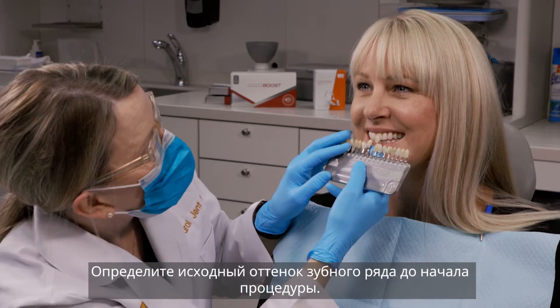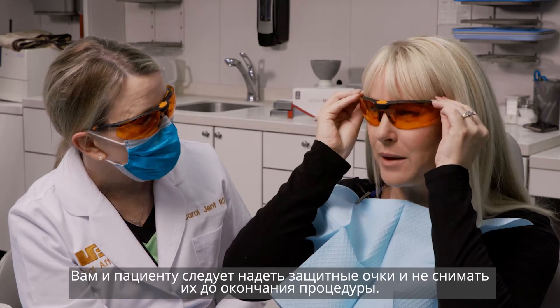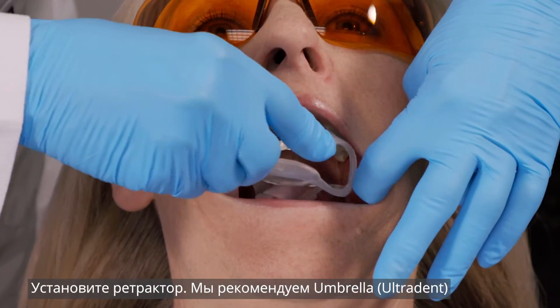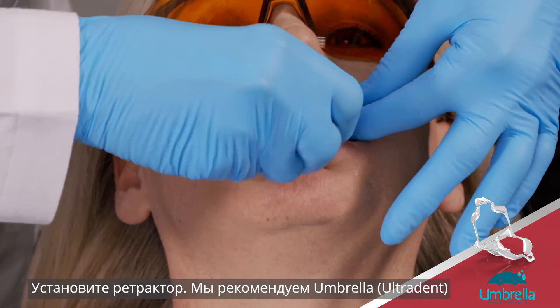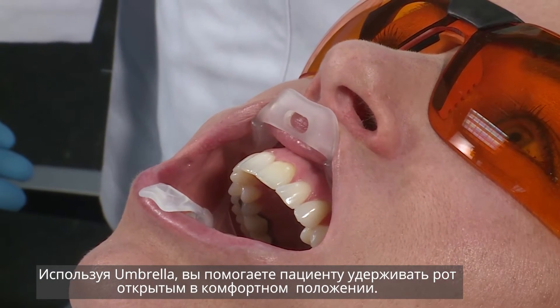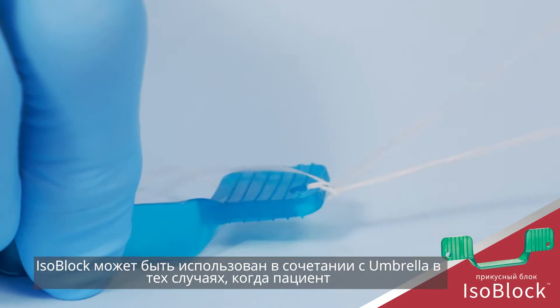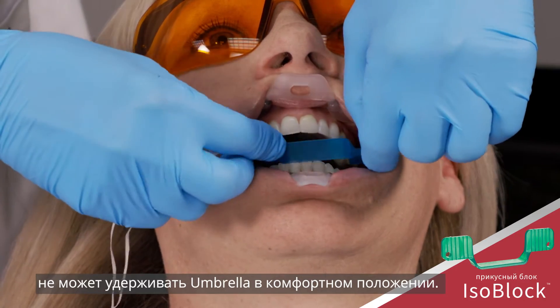Determine the patient's initial shade for your records. Both you and the patient should wear protective eyewear during the procedure. Place a self-supporting lip and cheek retractor — we recommend the Ultradent Umbrella Retractor. Using the Umbrella Retractor helps the patient stay open in a natural and comfortable position. The isoblock can be used in conjunction with the umbrella if the patient is not able to rest passively with the umbrella in place.